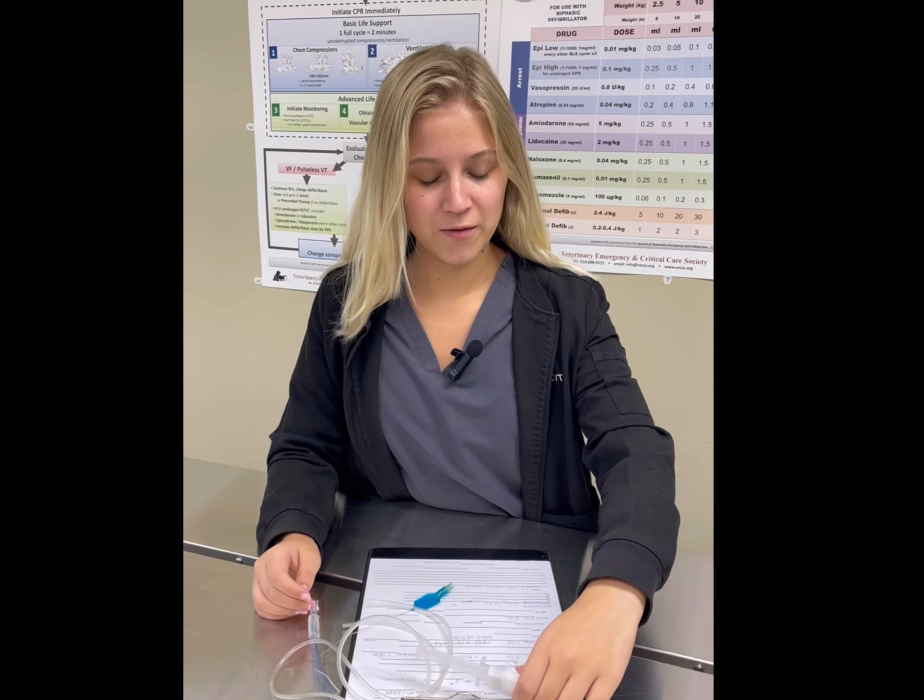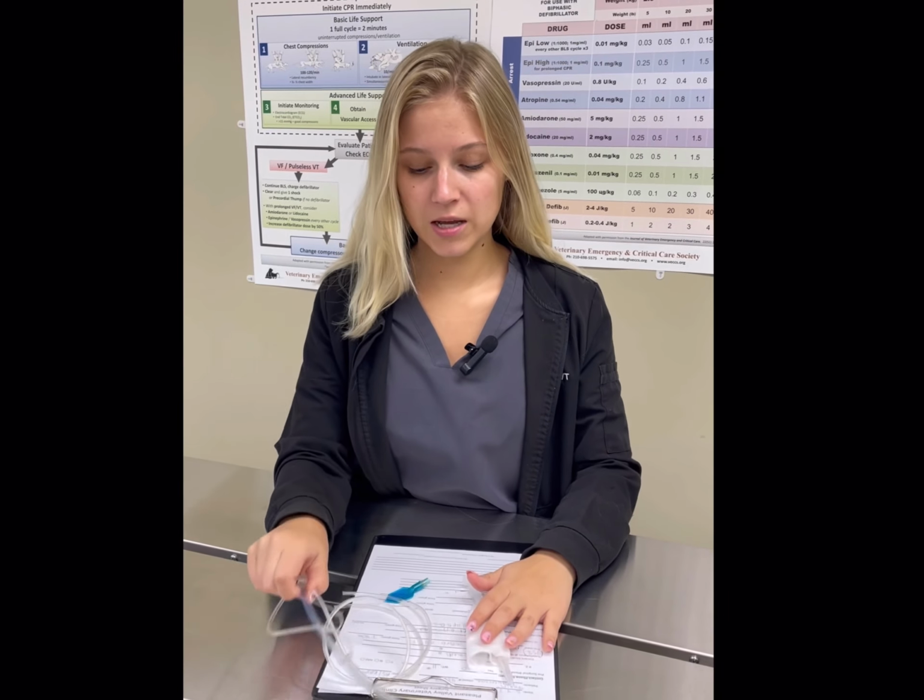All right, now I have Pickles' induction medication and his endotracheal tube picked out, so we can go ahead and get started with his dental.